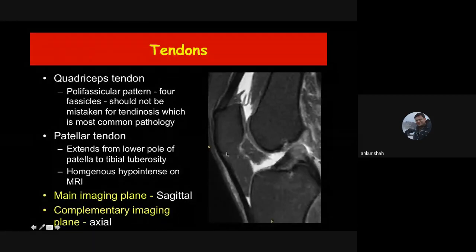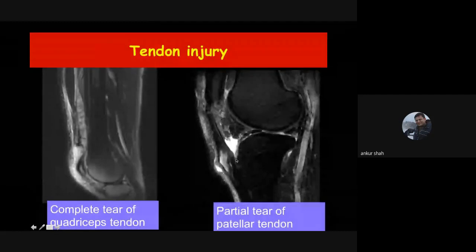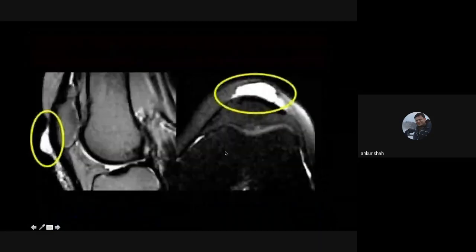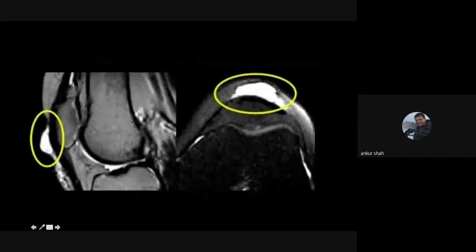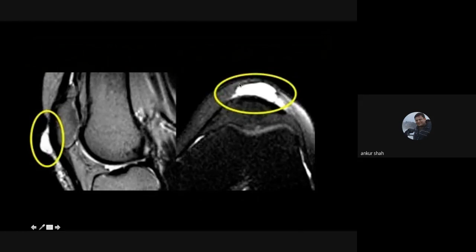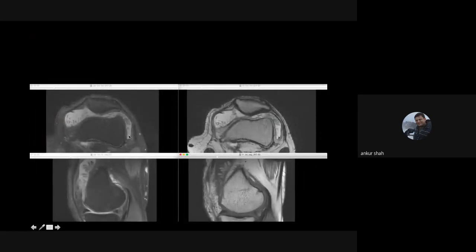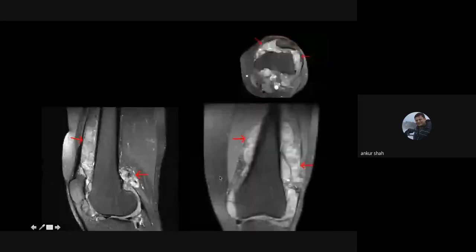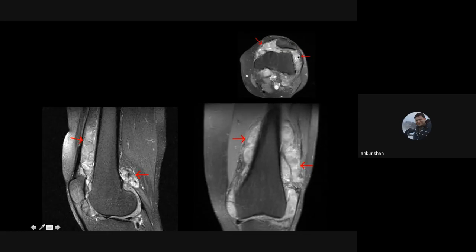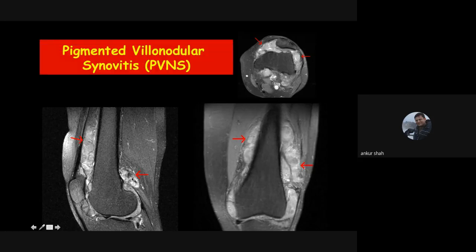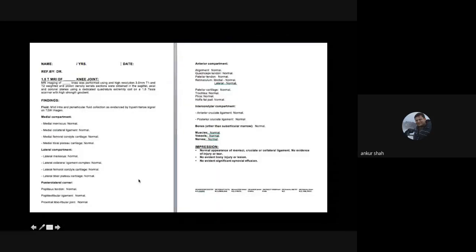Briefly about tendons: the quadriceps tendon and patellar tendon are most important, seen nicely in the sagittal plane — complete tear of the quadriceps tendon and partial tear of the patellar tendon can be identified clearly. Always look for joint effusion, baker's cyst, loose bodies, or plica. Fluid collection in the subcutaneous tissue overlying the patella is pre-patellar bursitis. Significant joint effusion with synovial hypertrophy and fat within the hypertrophied synovium is lipoma arborescence. Synovial hypertrophy with erosions and areas of hemosiderin on gradient images is the classical appearance of pigmented villonodular synovitis (PVNS) — differentiable from tuberculosis which would not show hemosiderin.